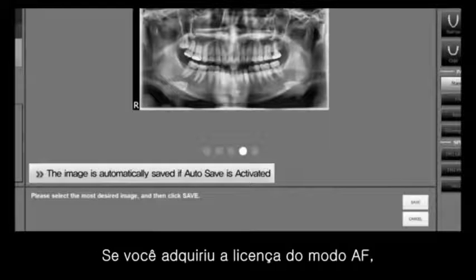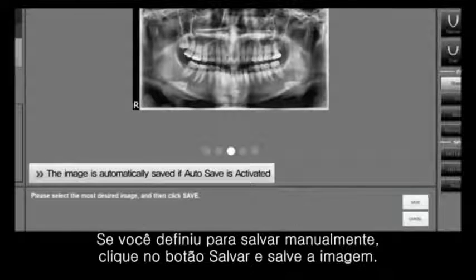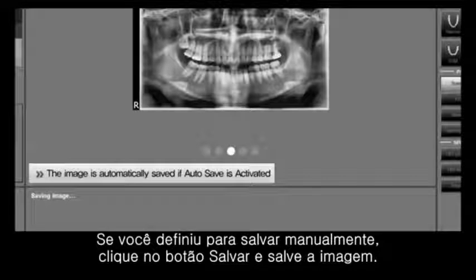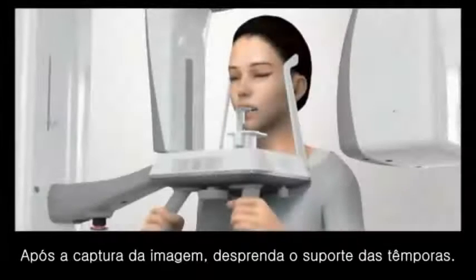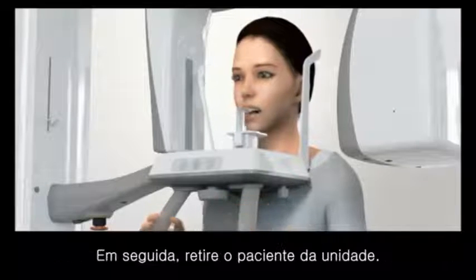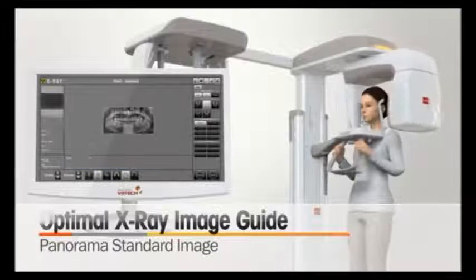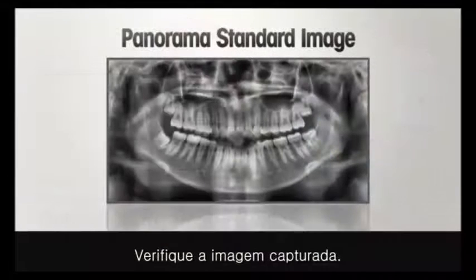If you purchased license of AF mode, select and save the optimal image using mouse wheel. If the manual save is set, click the Save button to save the image. After the image capturing, unfasten the temple support. Then guide the patient out of the unit. Check the captured image.